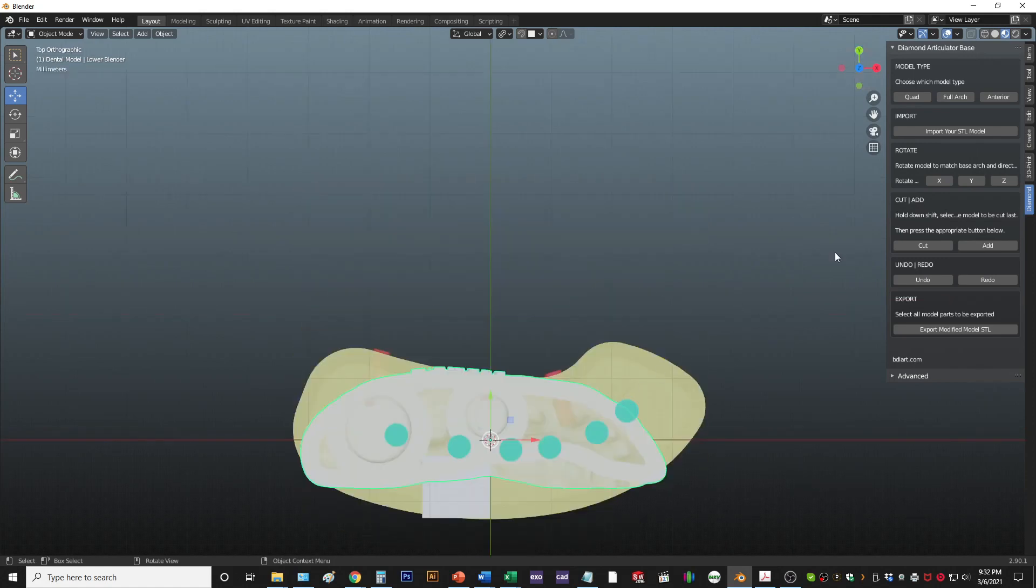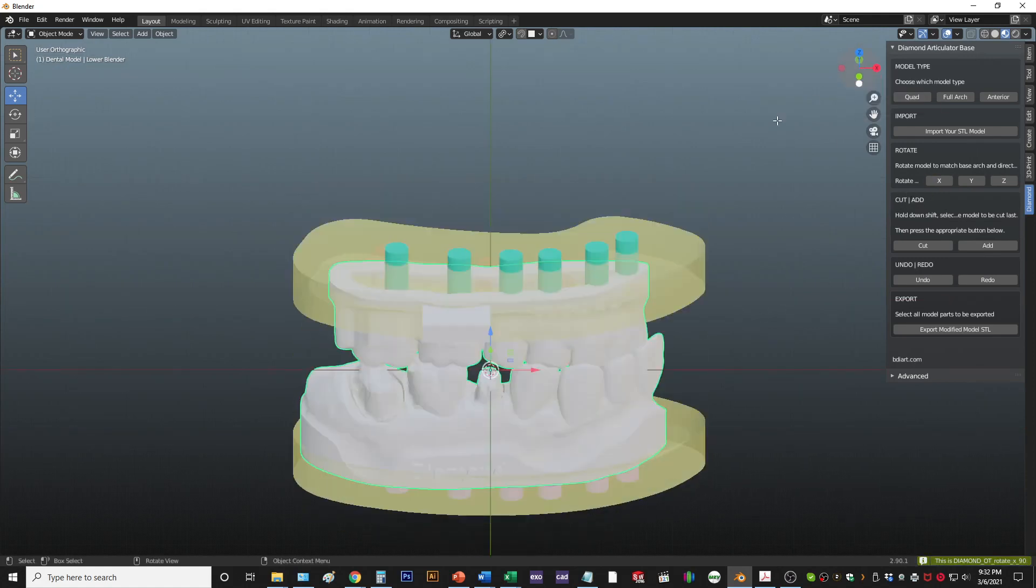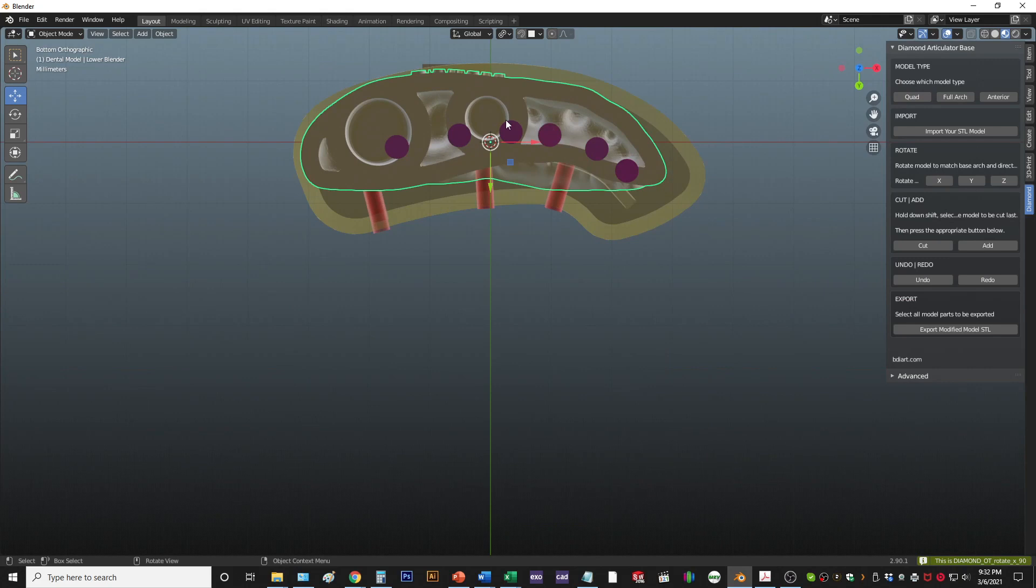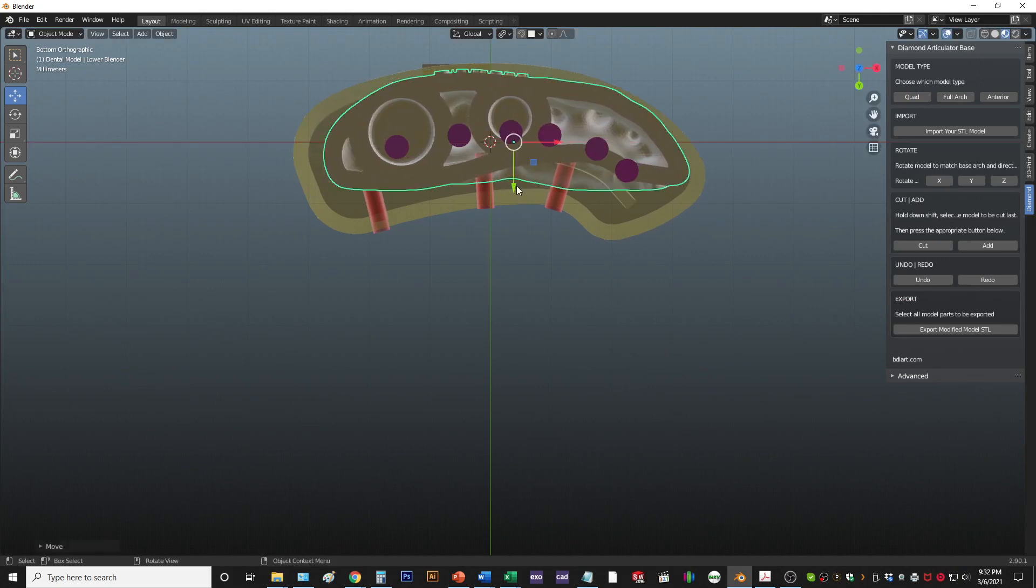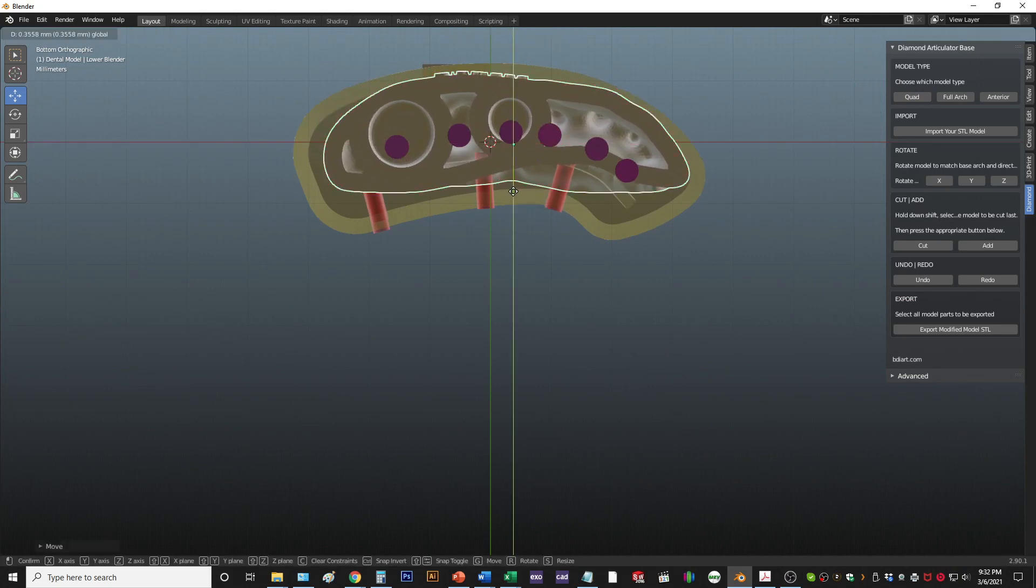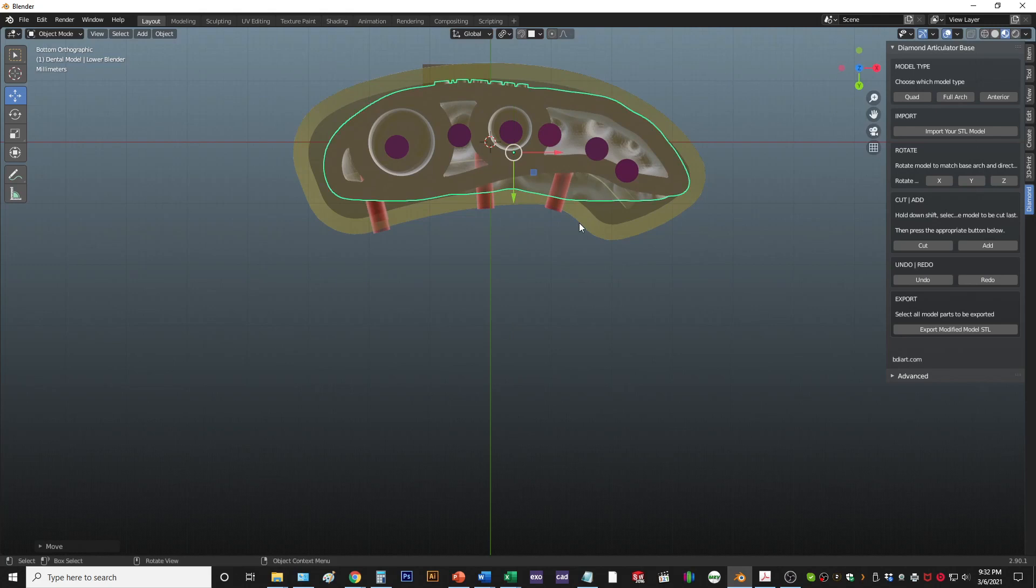From here, I go to the Z view and I align the model to the base. Then you can move the model to align to these pin markers.